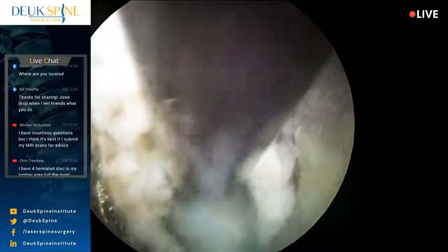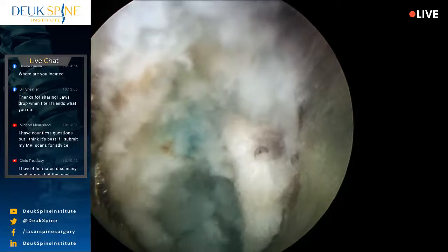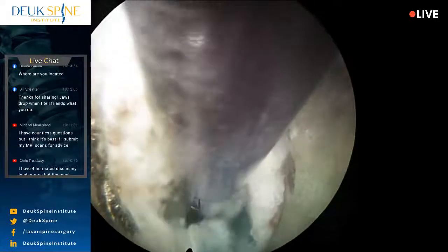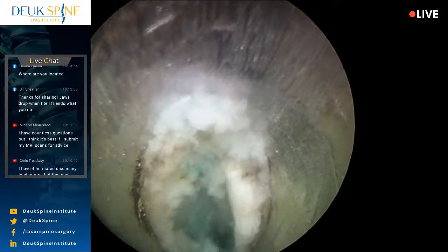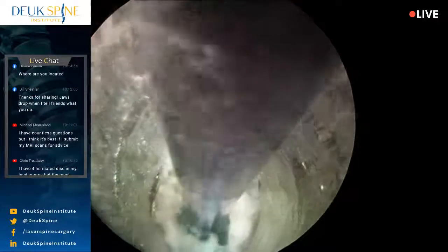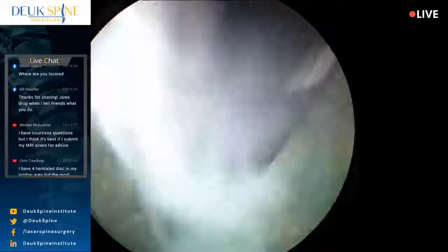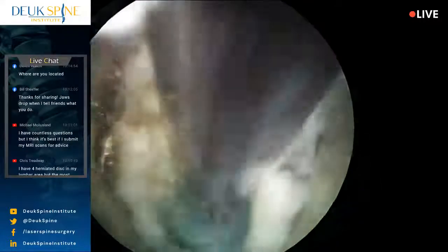So basically, the nerve roots are big. They're big white cables. They're about the same diameter as this grabber that's going in, the metal grabber. If you look at the metal grabber, you'll get a pretty good idea of what the diameter of the nerve root is. And they're just outside the walls, both walls, two walls of this retractor.